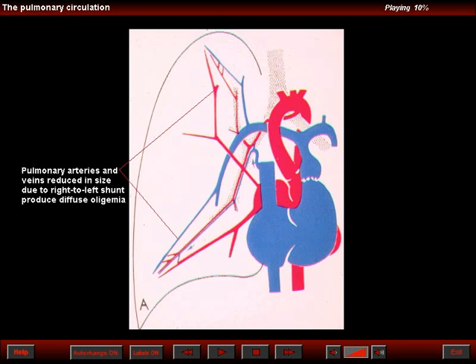Diffuse oligemia can be the result of a right-to-left shunt. Another beautiful diagram of Morris-Simon shows the reduction in the caliber of the pulmonary arteries and pulmonary veins as a result of a right-to-left shunt.